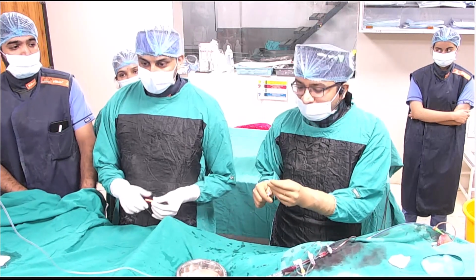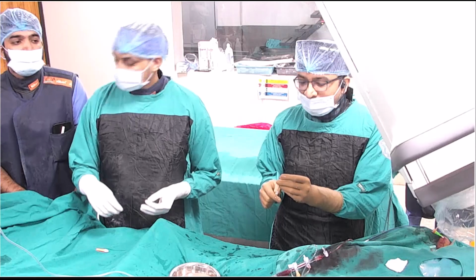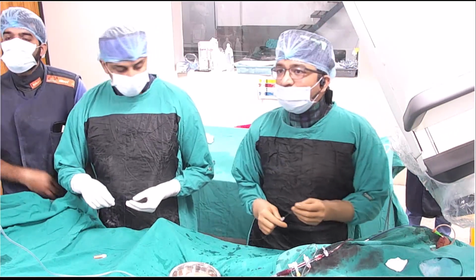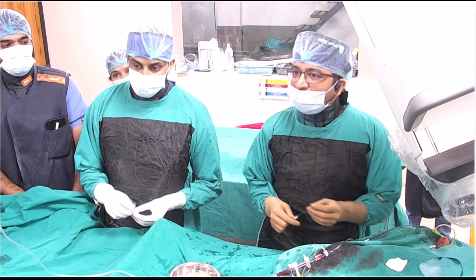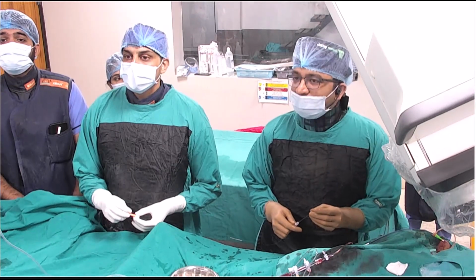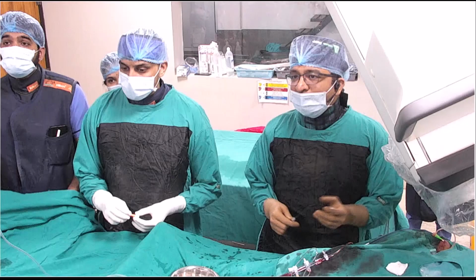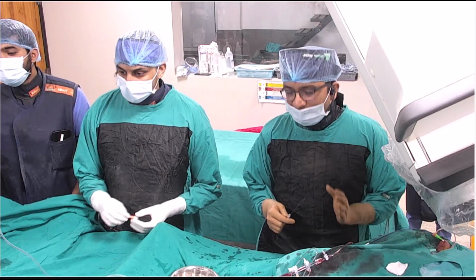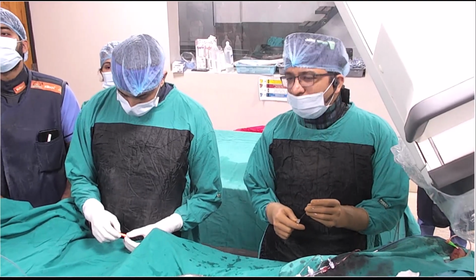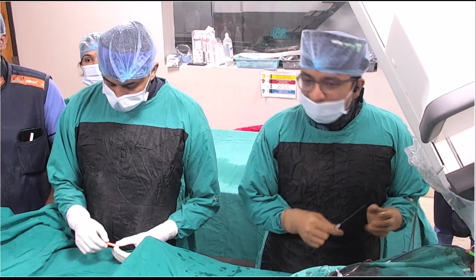So we were supposed to do a left main bifurcation initially, which will be taken up second. But here is a case where we have a 44-year-old male presenting with anterior wall MI. Today is day 3 of MI. He was thrombolysed outside, but he continues to have exertional angina. So he's having post-MI angina, and on echo he has hypokinesia of the apex as well as the apical septum. Rest of his EF seems more than 45%, and we have taken him up for an angiogram.